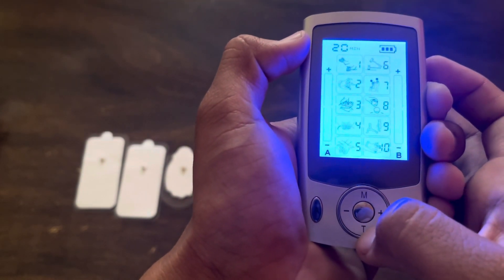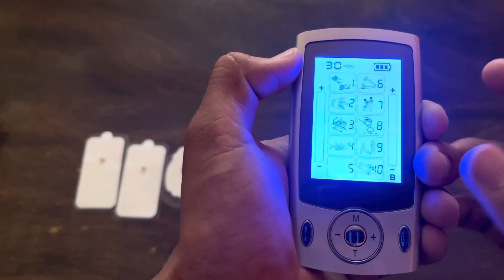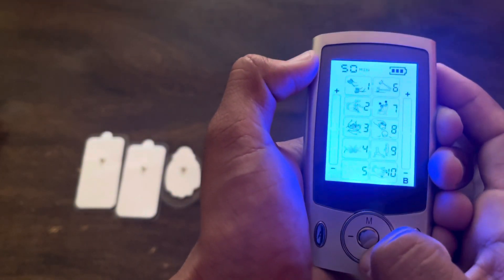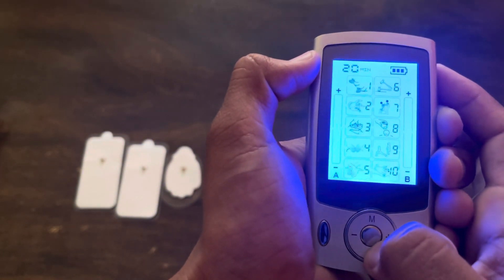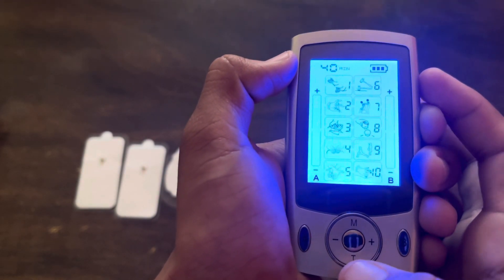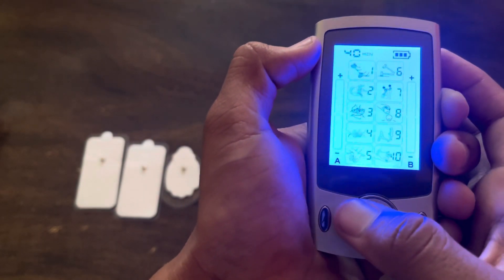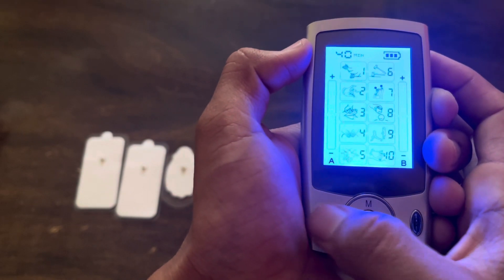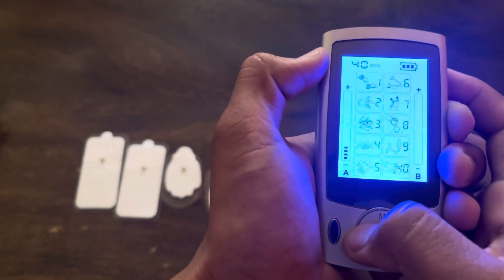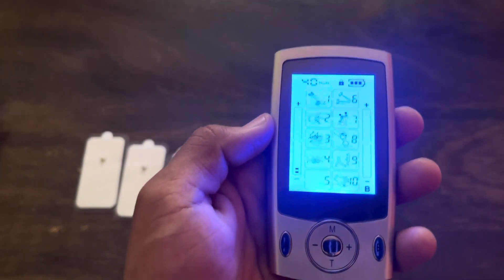There is also a T button given just below the M button, which is used to select the duration. At the topmost corner of the display, the duration is shown. By pressing this T button, we can select the duration. There is also a minus and plus button which is used to decrease and increase the intensity. I am now selecting channel A and increasing the intensity. By pressing the minus button, you can decrease the intensity. It is pretty easy to use the unit.